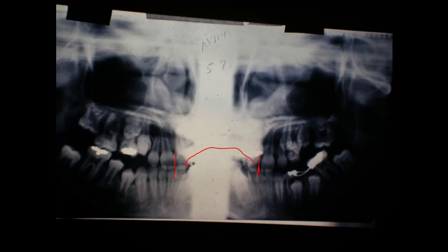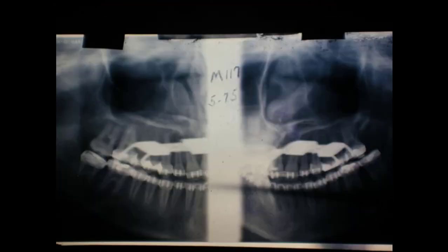The second molar is drifted forward in here — you'll notice on this part — and we're getting closer to the time we'll start the case. We're watching to get that upper right second molar. Here it is in 5 of 75.